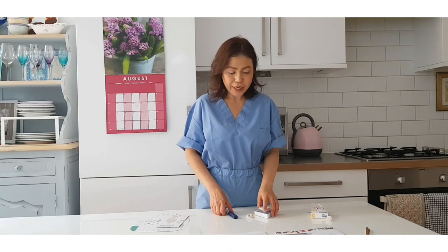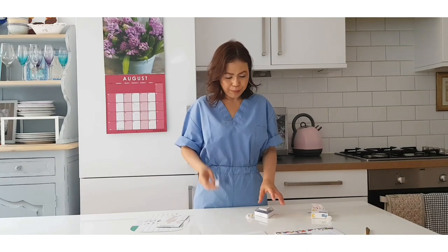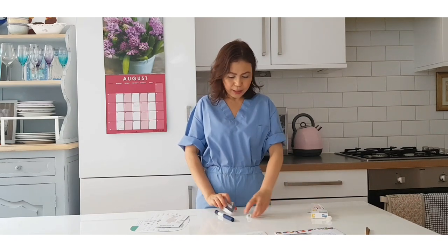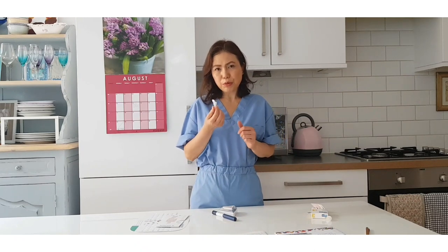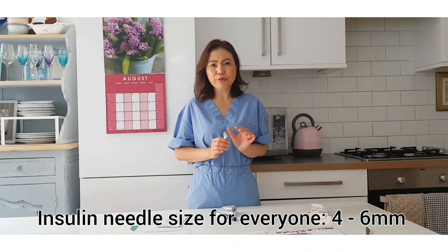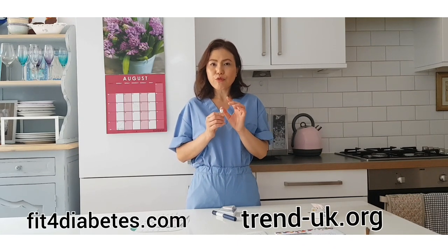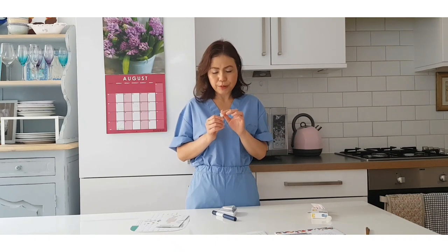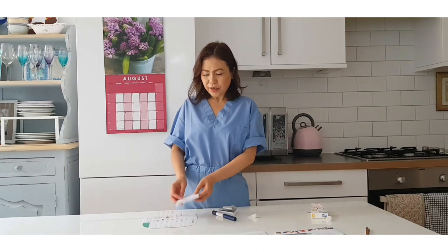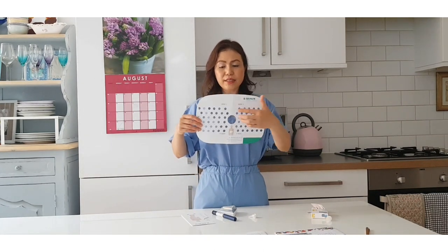I have the insulin training pen here, and this is where I'm going to show you how to inject insulin. I also have some disposable needles. The size recommended by TREND UK and the Forum for Injection Technique is four to six millimetres - so it's quite thin. I also have a diagram here for the abdomen, as you can see with the polka dots.